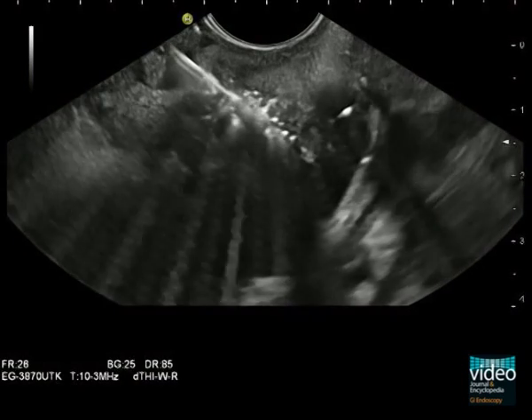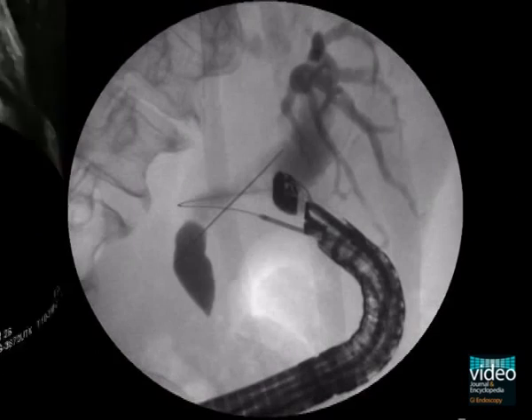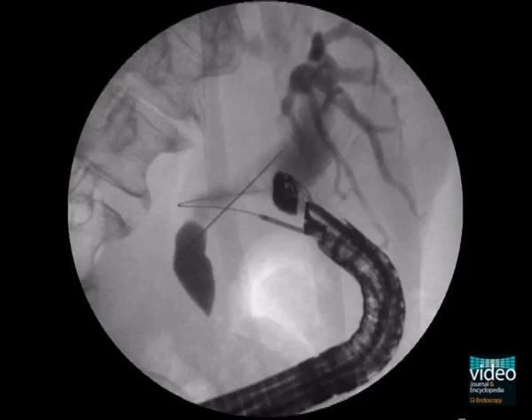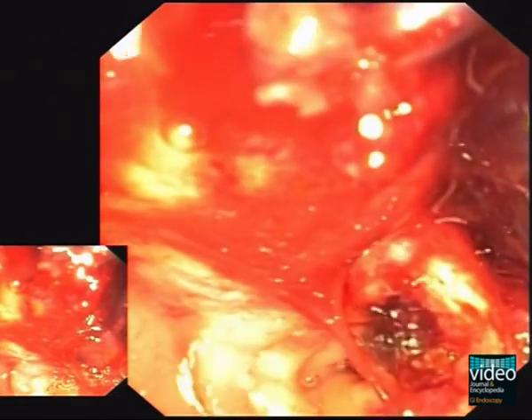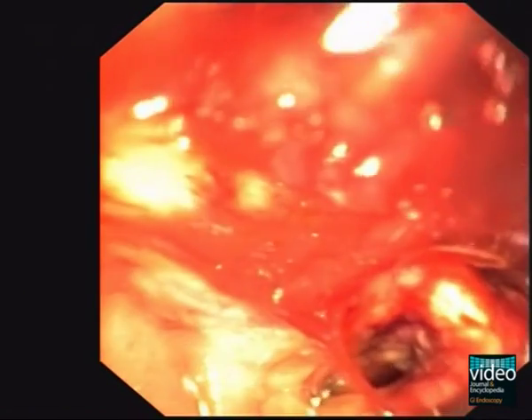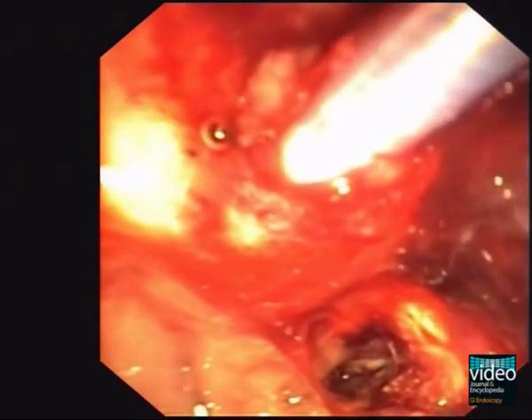Over the guidewire, a high-frequency ring knife is pushed forward up to the duodenal wall. Under changing EUS and fluoroscopy control, the motion of the ring knife during high-frequency cauterization is followed carefully. This manoeuvre should be done two or three times depending on the distance and the resistance of the intermediate tissue.